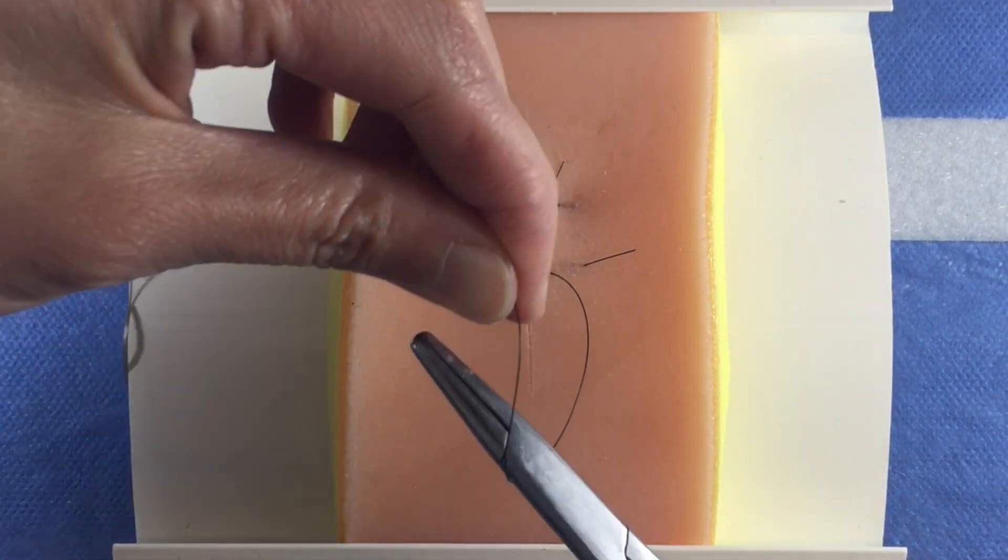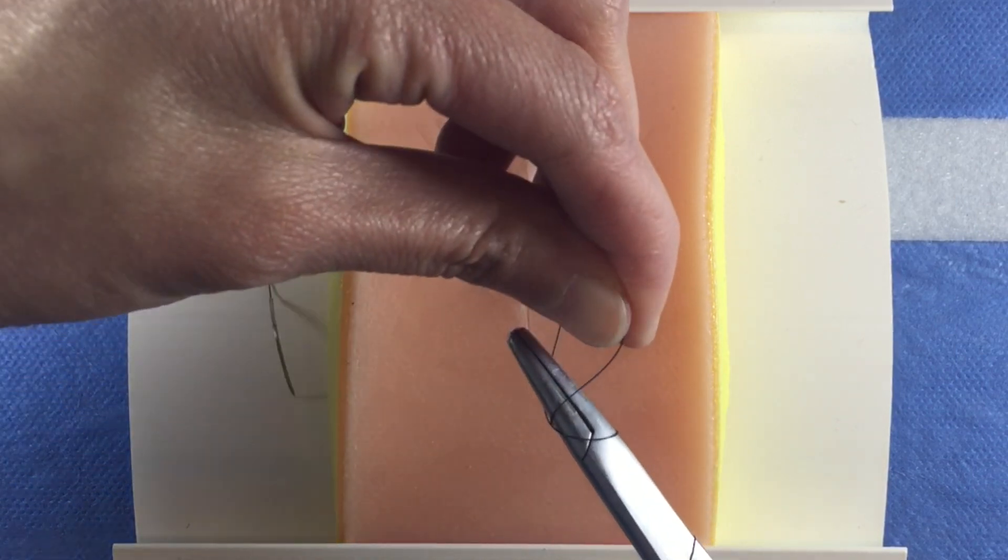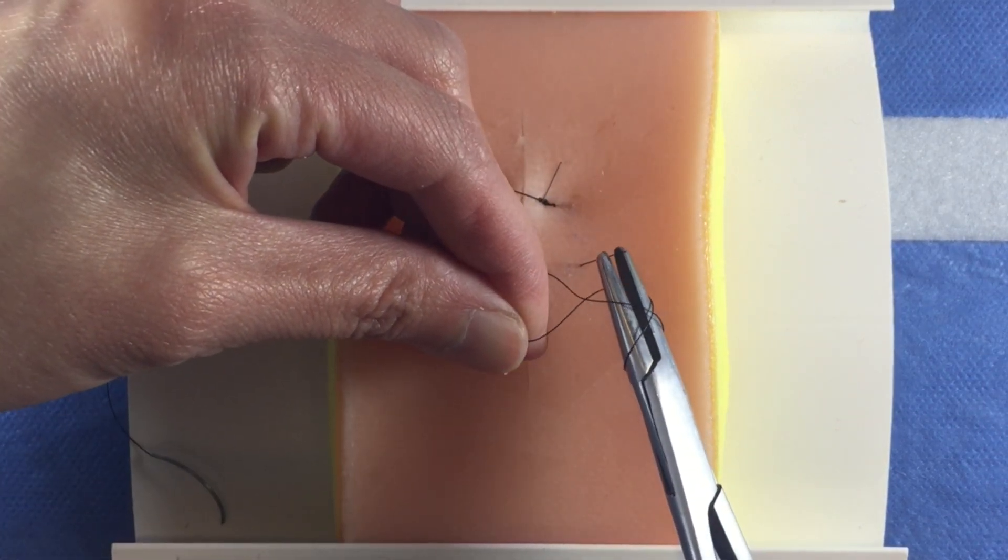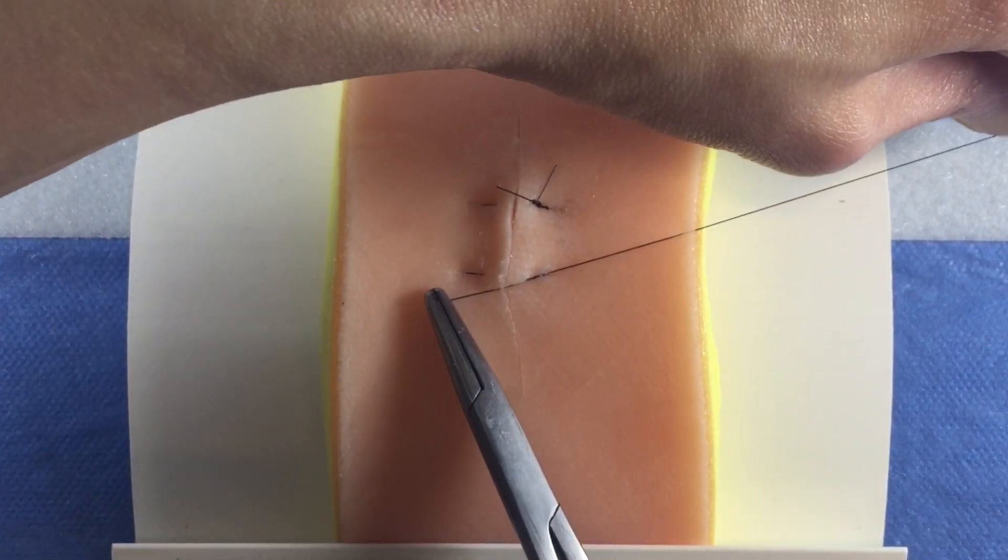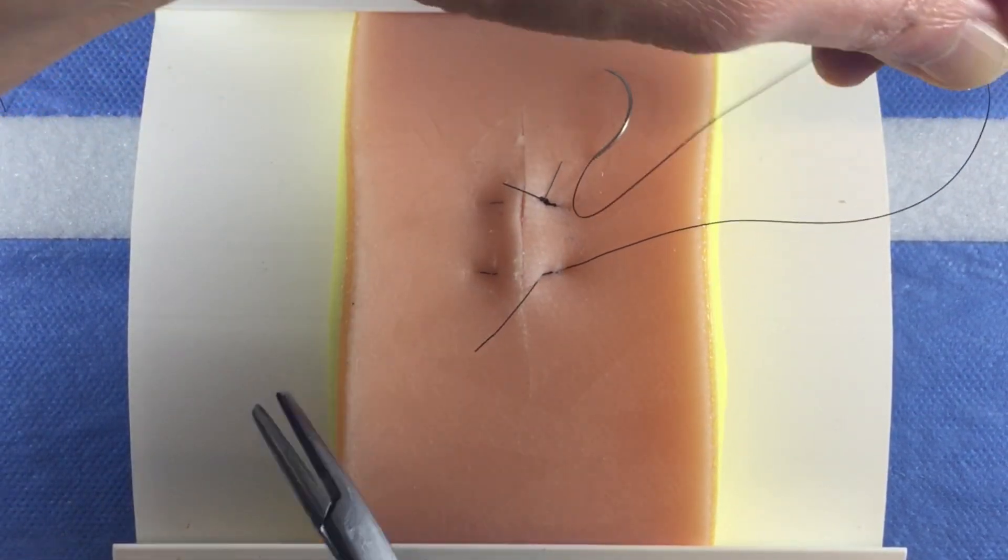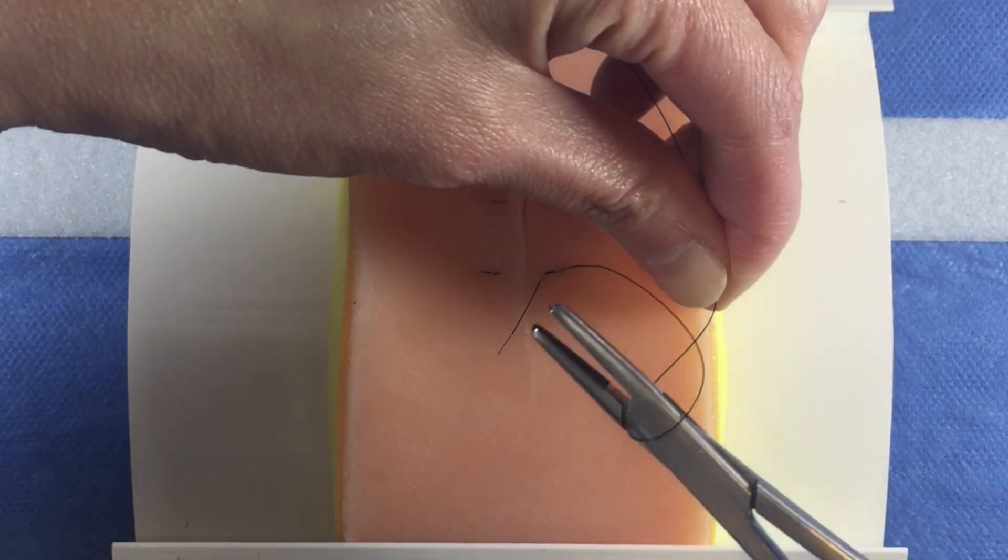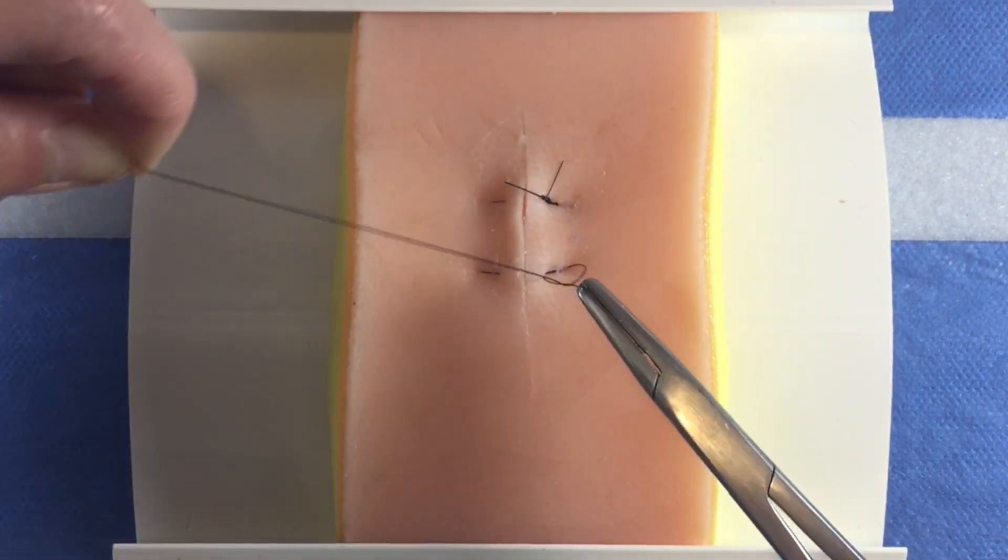Then, tie the suture strands together. Note that there may be significant tension requiring you to place a surgeon's knot or several slip knots in order to make the closure snug. But also remember to approximate, not strangulate.